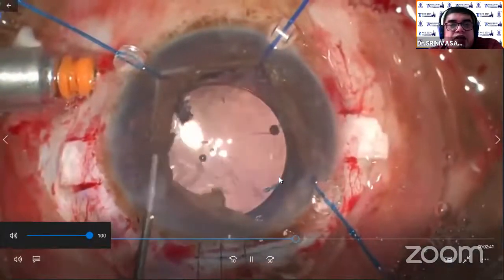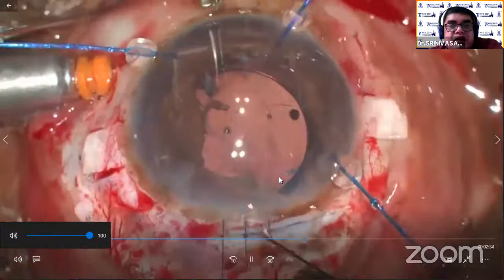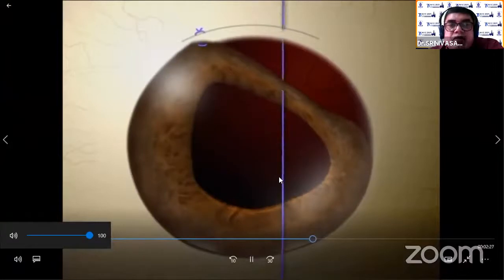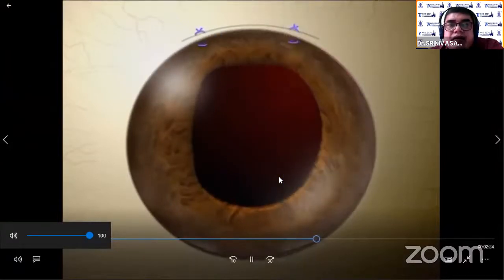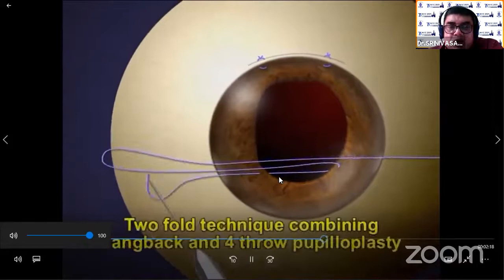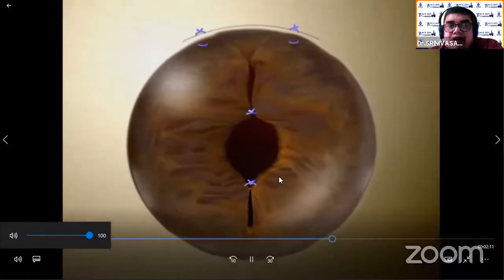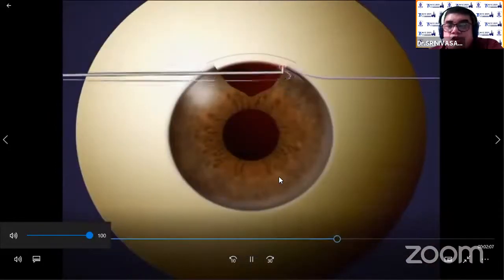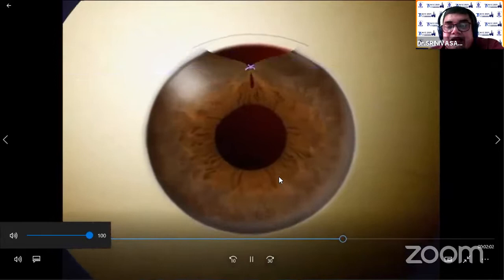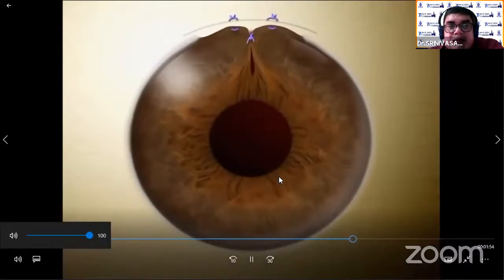The anterior chamber is created. Now I have an iridodialysis to repair as well — the pupil is distorted. So I am using, as advised by Michael Schneider, the iris hangback technique. This can be done only if there is less than 3 clock hours of iridodialysis. I am going to use the pinhole pupilloplasty technique to repair the pupil. The iris hangback technique — if it is less than 3 clock hours, you can suture it with a straight needle with a 10-0 prolene suture, so that the iris, if left like that, will cover the trabecular meshwork by the peripheral iris and produce a rise in intraocular pressure.